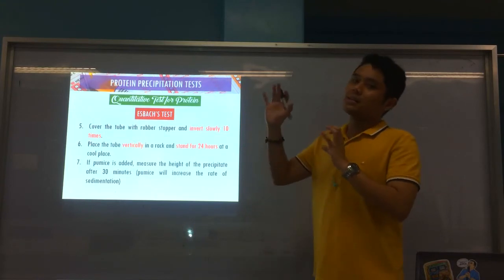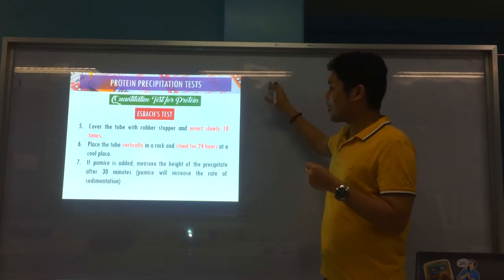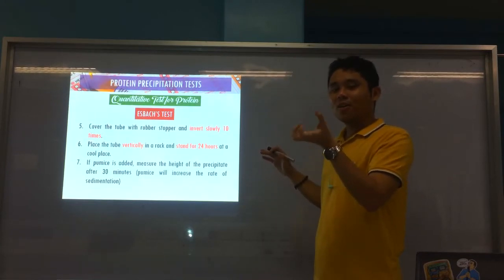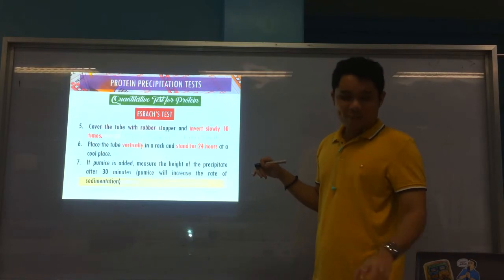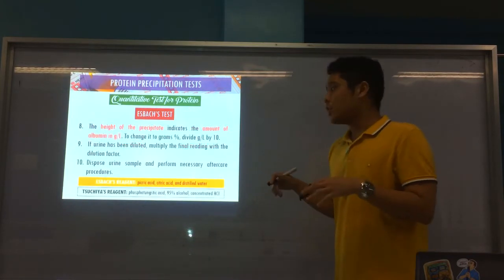Okay, sa pagmix sa reagent and sa protein, therefore easy po ang pag-sediment, or meaning pag-tapok sa ilalom, or para kanang easy ra pud siya mo-precipitate. Okay, all right. So that's the purpose of your pumice.